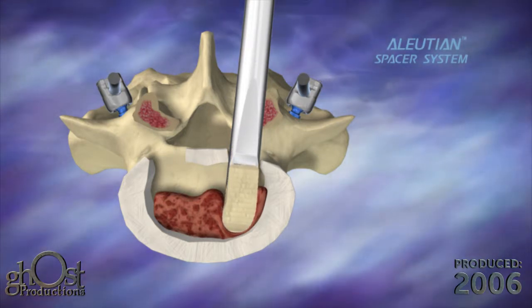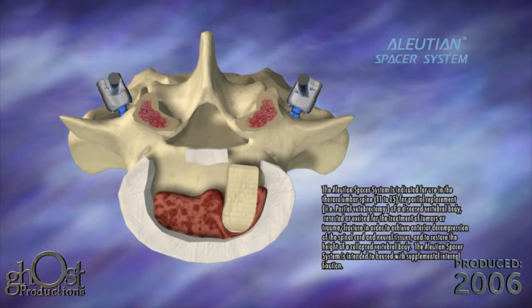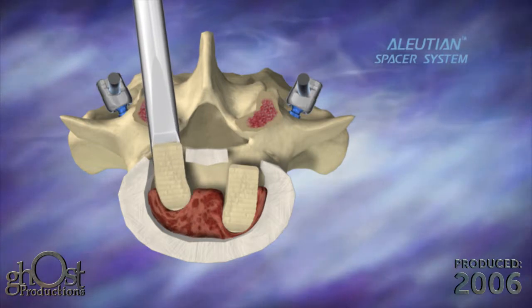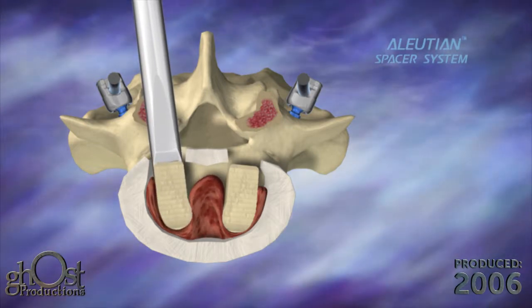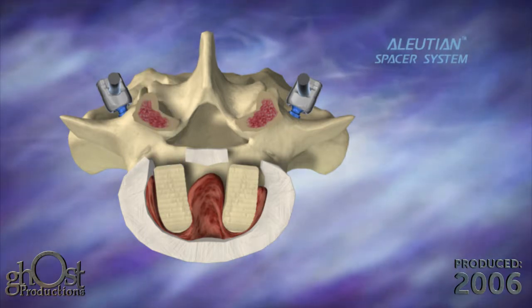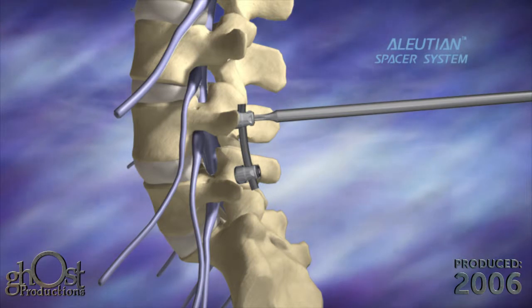With appropriate neural element retraction, the implant is introduced into the space. The implant may be disengaged by turning the thumb wheel of the inserter in a counterclockwise direction. X-ray or fluoroscopy may be used, live or periodically, to verify placement.